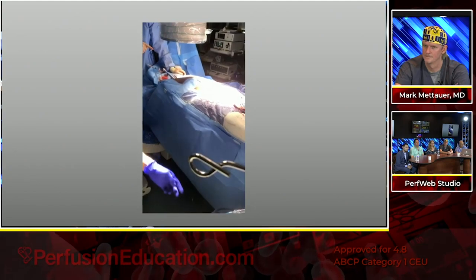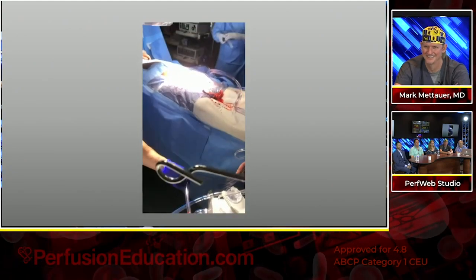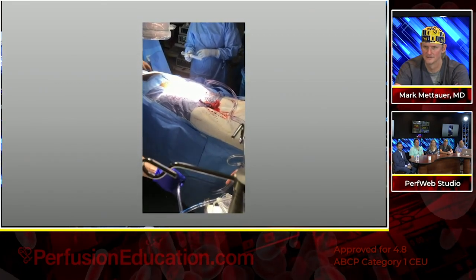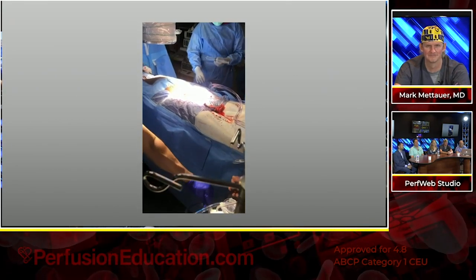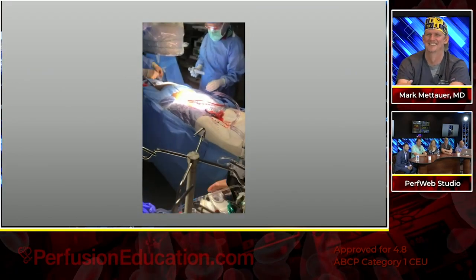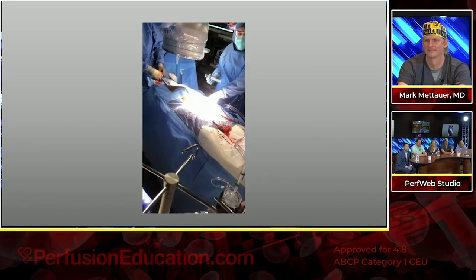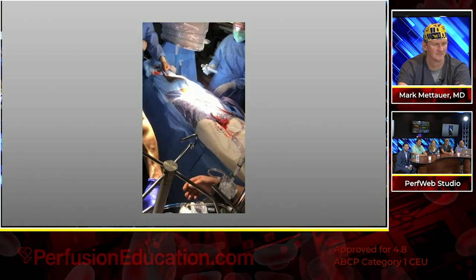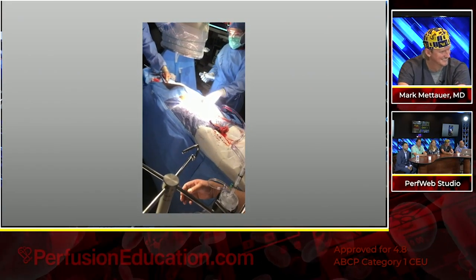Coming toward you, okay? Turn it up higher. Are you having problems? Yeah, we're not seeing flow. Ready? I've got everything. This is where I accused Joe of having the pump backwards. No, it wasn't backwards. It's coming. This is going here. This is going there. We just got a lot back from the return side. Yeah, that's okay. Turn it up higher. What are the RPMs yet? Turn the flow up. Turn it up. Now we're going.